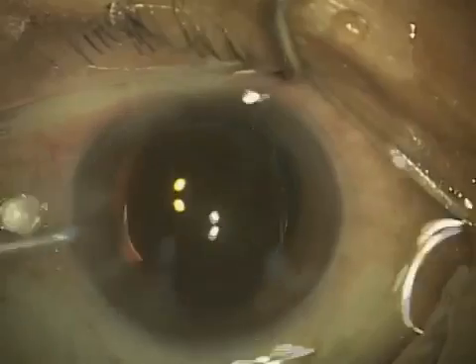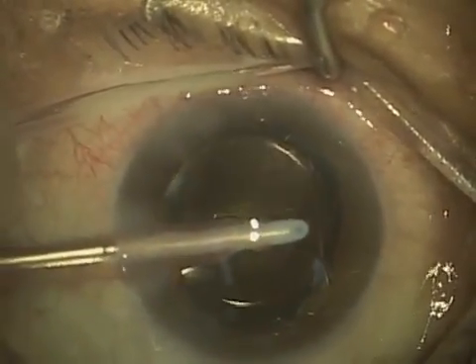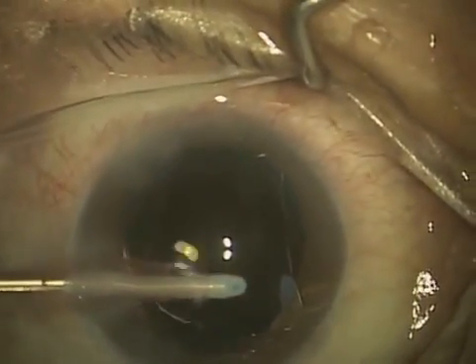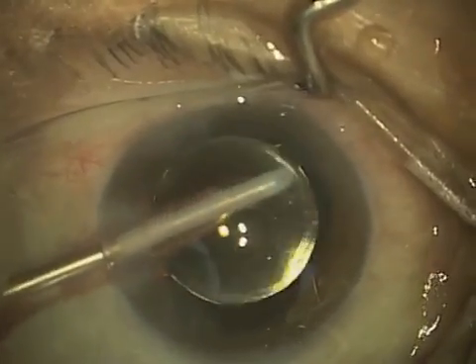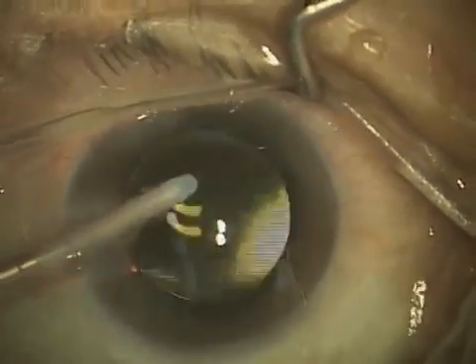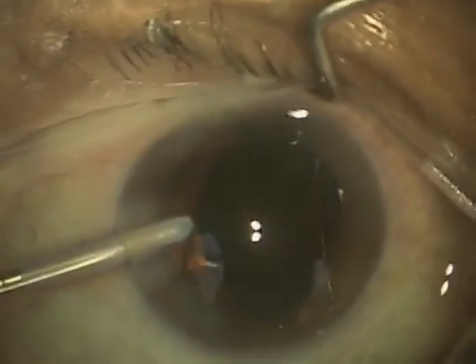This here on the left is the coaxial irrigation and aspiration handpiece. You just saw some of the irrigation, and that's going on right now — I'm aspirating or removing the viscoelastic material from the inside of the eye. And right now I'm in front of the lens.